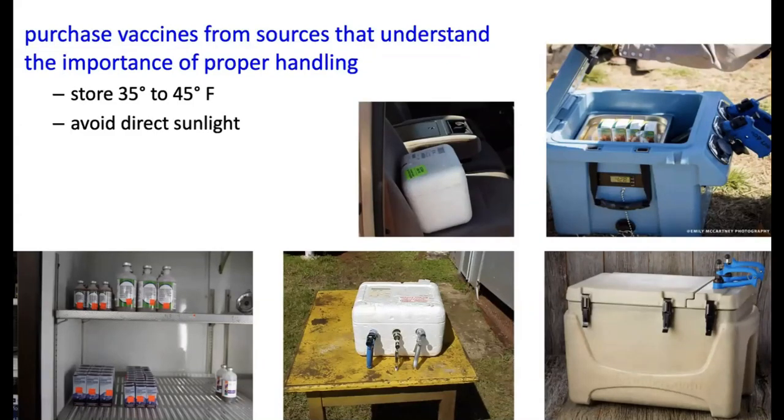So when we're thinking about syringe selection, one of the things we think about is making sure we protect that vaccine. We always talk about protecting the vaccine when we pick it up and when we have it at the house before we're using it. But it's also very important to protect the vaccine chute side before we use it, and then also while it's sitting in that syringe. Because if you have 10 doses in that multiple dose syringe, you may be rolling along pretty good, but then something happens, and so you're delayed for several minutes. You don't want that syringe with that vaccine just sitting on a table or something out there chute side. We want to make sure we keep it cool between every animal and use.